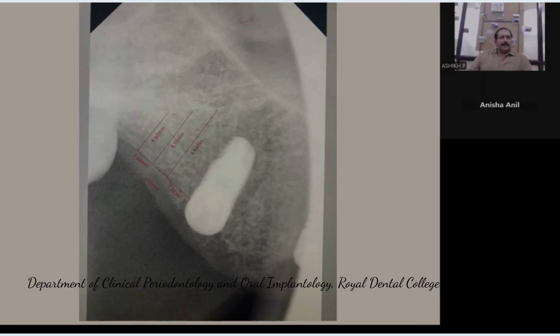The sinus is not a very easy thing to be penetrated. It's not going to break like a bubble or something, but it offers some amount of resistance, totally dependent upon the way that tooth stayed there. It had a palatal root, possibly, and two divergent buccal roots it would have had. We don't know, we are not sure about it. We are not seeing the prior X-ray from before the extraction of that area. The palatal side will always have some better bone support, right? So you put it in the right position and try doing it.